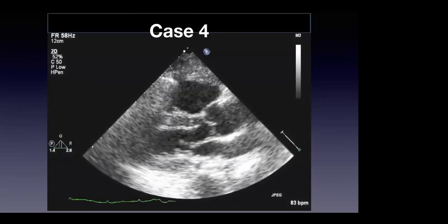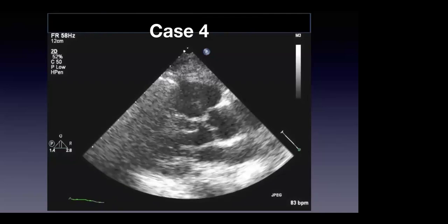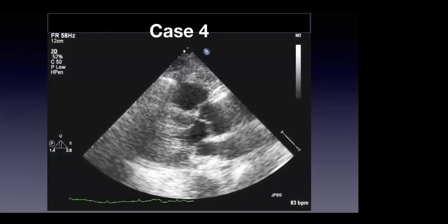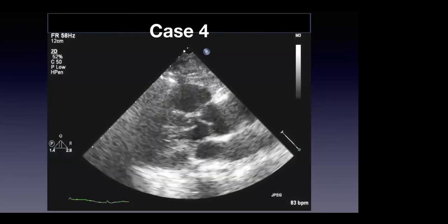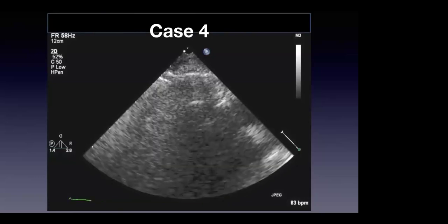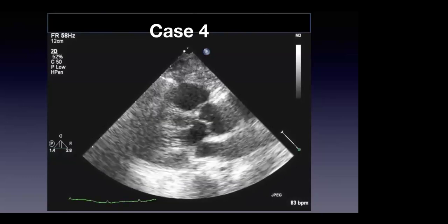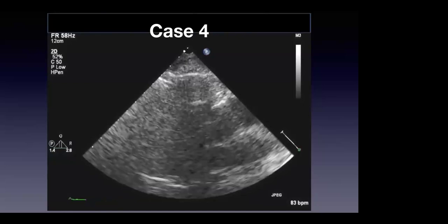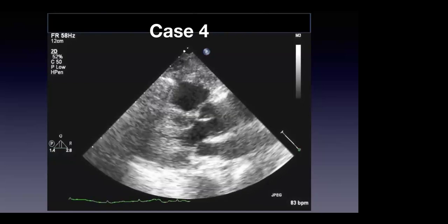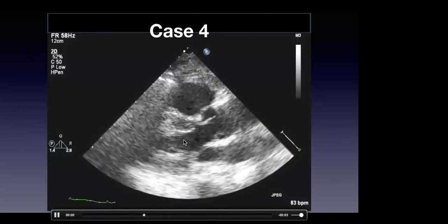This one's not hard. Parasternal long. At first glance, there's no pericardial effusion. I wonder if the walls look a little thick with the LV. At least concentric remodeling, right? The LV is small. Function, I don't think it's normal. I think I would say low normal at least. Yeah, it's tough. It's a little tangential. It might be going in and out of plane a little bit here.